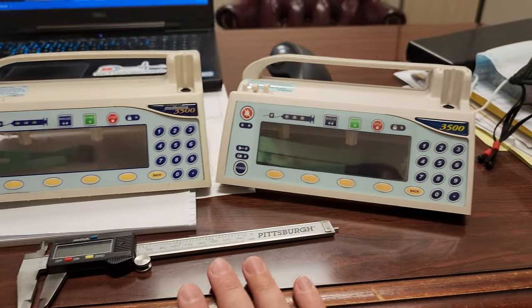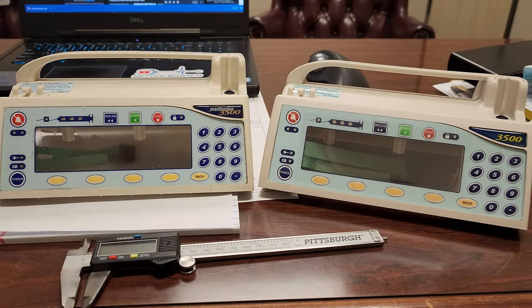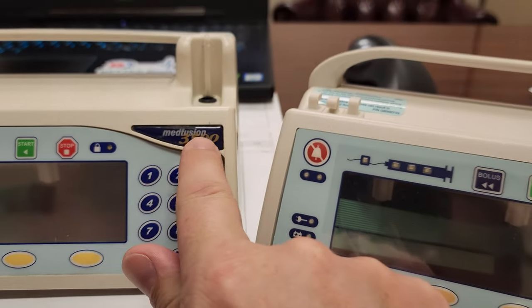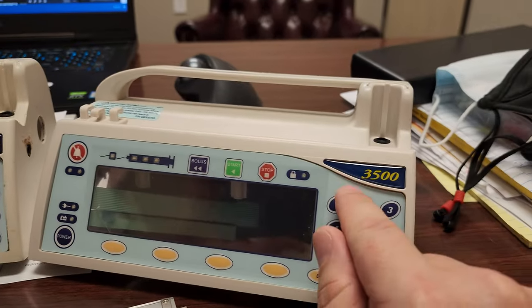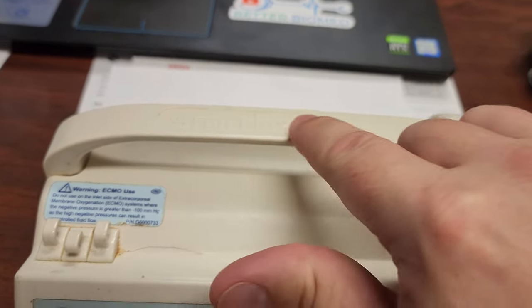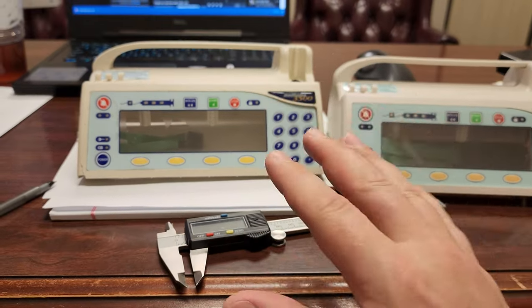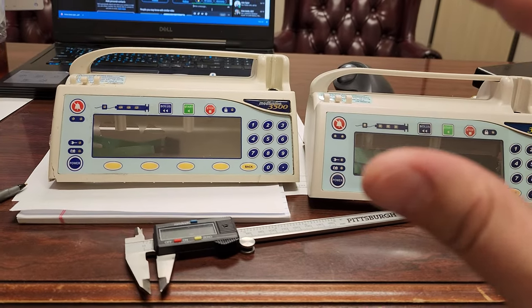This is one of the first other products they've sent me, and normally — if it wasn't for one being so dirty — you'd have to really look to notice that this is actually a third-party product. There are a few identifiers: one is 'MedFusion 3500' — MedFusion is trademarked so they can't put that on there, but they put '3500.' Also, it says 'Smiths' on the OEM and up here it's just a blank spot, since they can't use the Smiths name either. But when it comes to the product itself, they are almost completely identical.